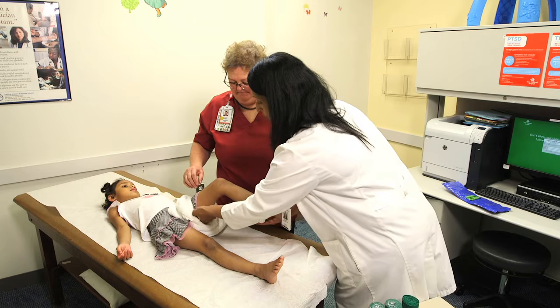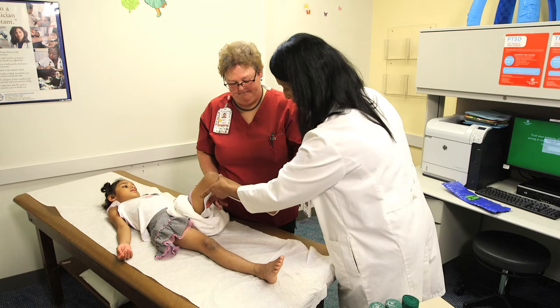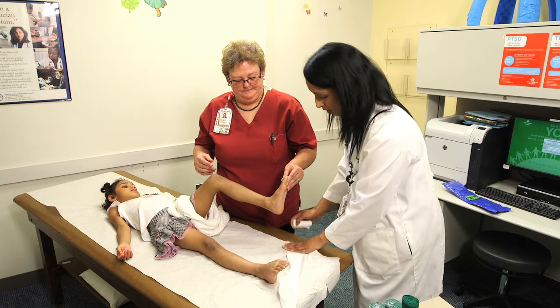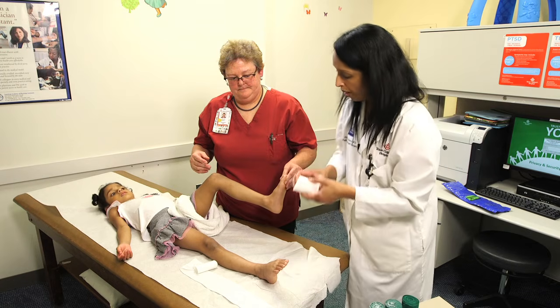So if we're doing an above knee splint, we're going to start above the knee here, take the splint material all the way down into the toes. This gives us a rough estimate as to the total length that we need for our splint. Once we get that, we can now begin wrapping the patient.